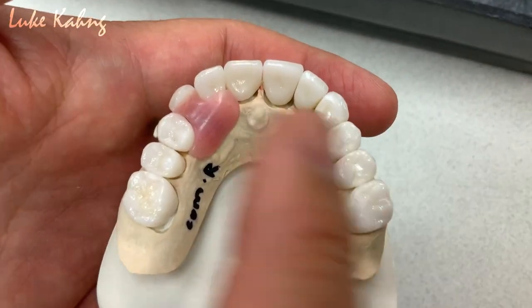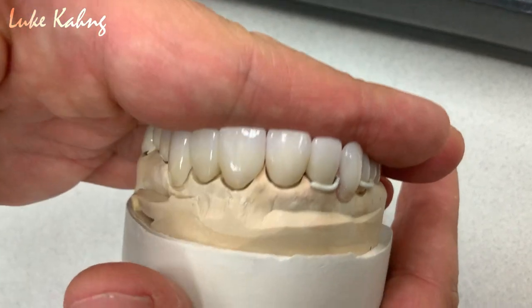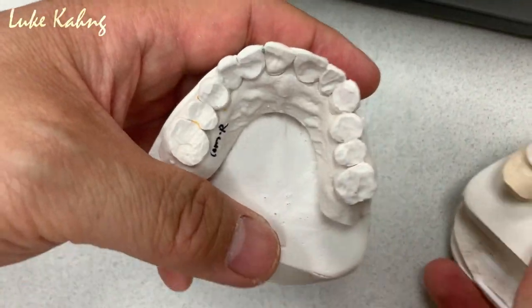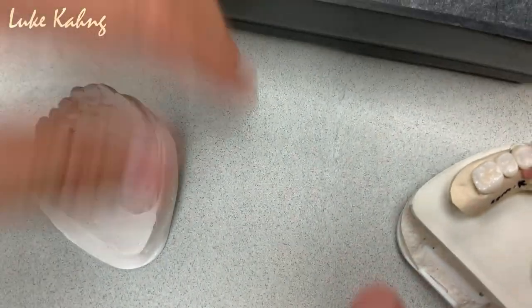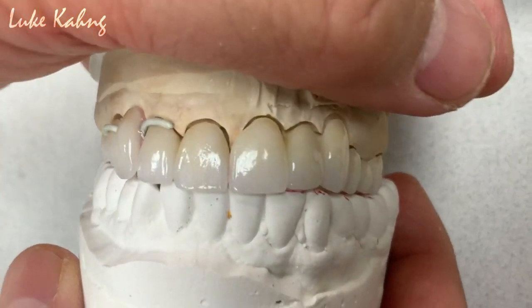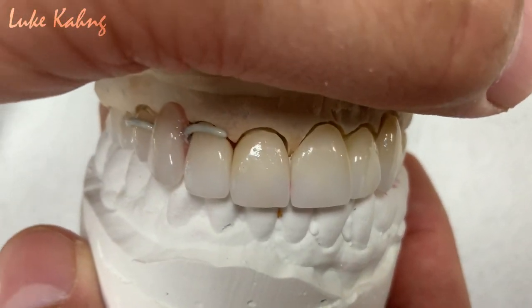Okay, so this is all monolithic. But here are the facials. We finish them up to final work. So you saw all the cases from here. The patient is going to do the implant here after they cement it. We also checked occlusion as well. Alright, so this is the final. Can you make up? Okay.